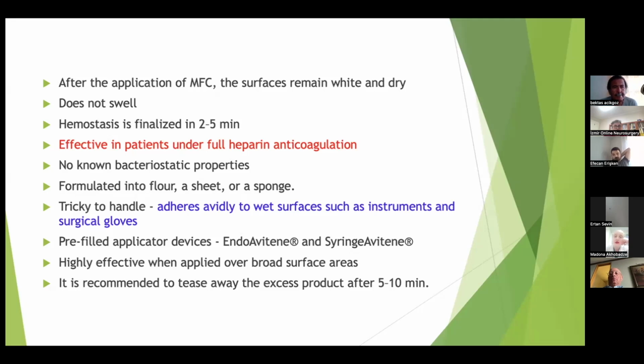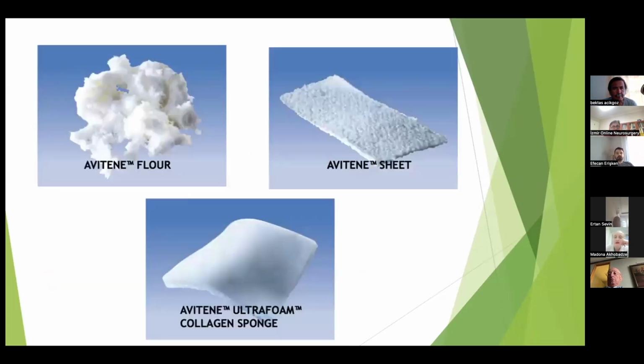And regarding MFC, the sometimes irritating part is that it is very tricky to handle because it adheres to wet surfaces like instruments and surgical gloves. So everywhere it gets stuck. But there are some pre-filled applicator devices like Endo-Avitene and syringe Avitene, which can be quite useful in endoscopic surgeries. And it is highly effective when applied over broad surface areas, and it is recommended to tease away the excess product after 5 to 10 minutes. These are the different formulations of Avitene.